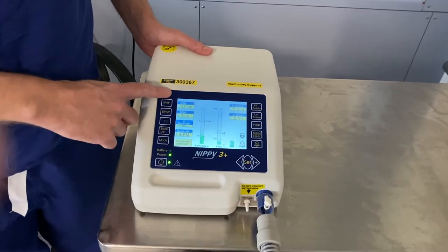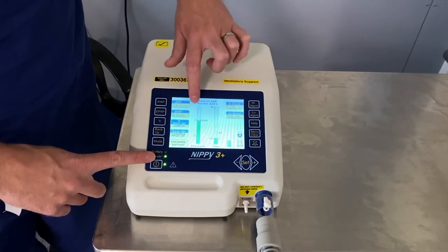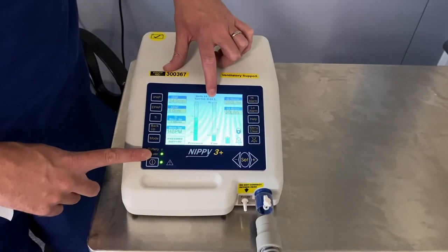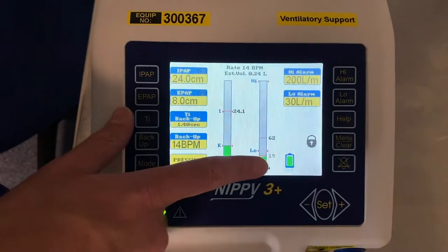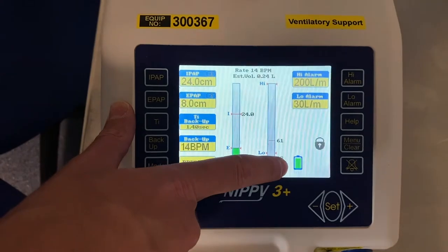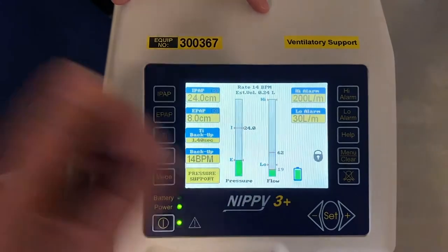All the settings that have been set for you can be found along this side of the machine. You've got two bar graphs here — one shows the pressure and the other shows the flow, which basically means how much air is being blown out of the machine. It has an internal battery built into the device, and you can see here this is what the symbol INT refers to. It gives you a quick idea as to roughly how much charge you have in the machine.